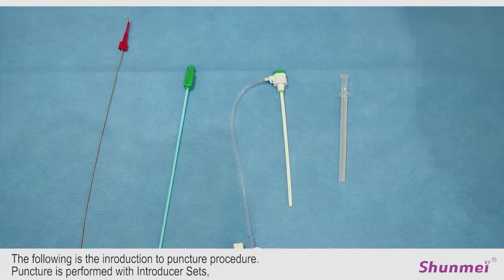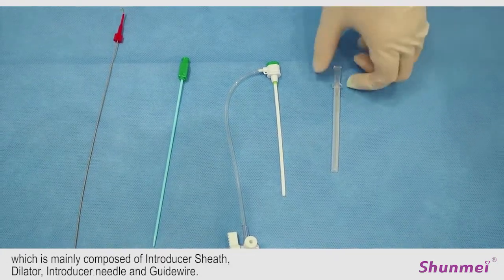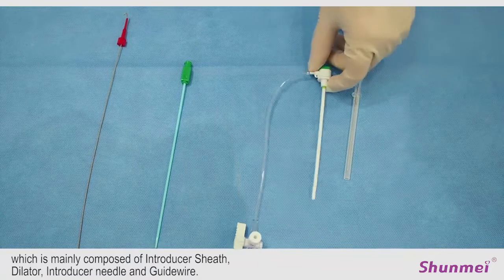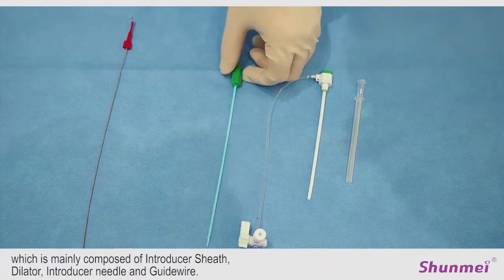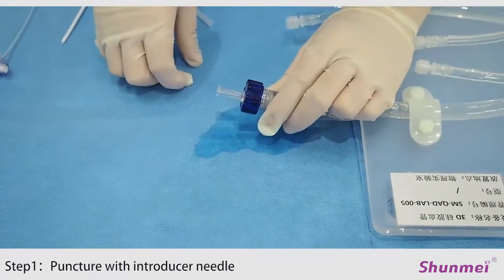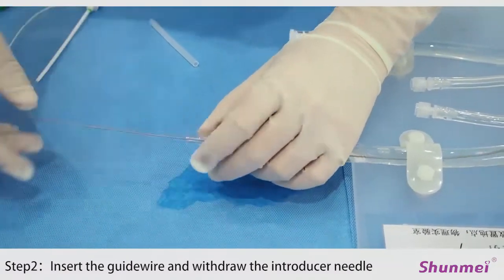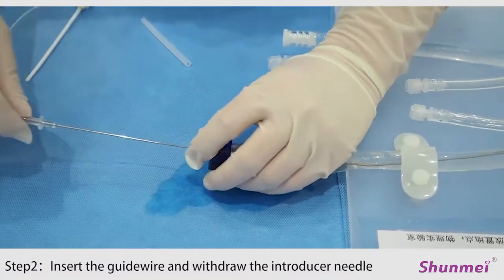The following is the introduction to puncture procedure. Puncture is performed with introducer sets, which is mainly composed of introducer sheath, dilator, introducer needle, and guide wire. First of all, insert the introducer needle for puncturing and introduce the guide wire along the introducer needle. Then, withdraw the introducer needle.